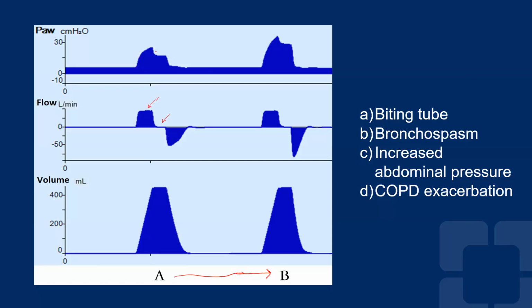And for that, I'm gonna just show you an image that will help you understand this. So this is the relationship of the pressure from the ventilator and if there's presence of muscle pressure, so the patient effort. In this graph, on the x-axis, you have a patient that is passive, so 0 pmus, all the way to the most effort that a human can do. And on the y-axis, you have 0 pressure, so a patient that is on no mechanical ventilation, and the maximum support that a ventilator can deliver.